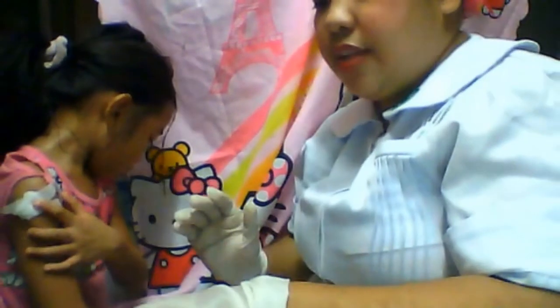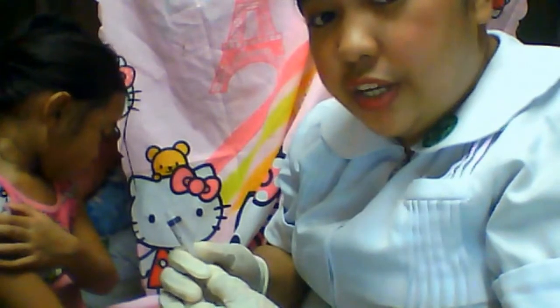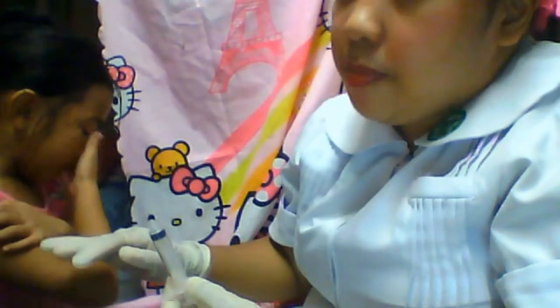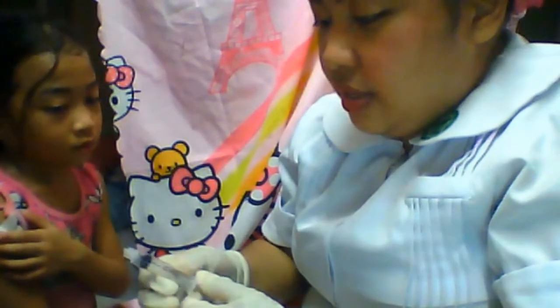Let's have the subcutaneous. For the subcutaneous, especially in insulin, it's normally done on the abdomen area. But you can also do the subcutaneous on the deltoid area. So the only difference is the angle and the way you inject the medication. For the subcutaneous, it's only 45 degrees, so half the angle of the intramuscular or the IM.